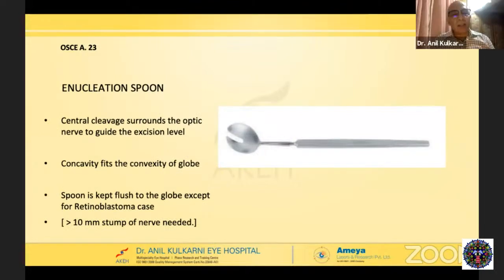The central cleavage is the one which surrounds the optic nerve to guide the excision level. And the concavity of this fits the convexity of the globe. Normally the spoon is kept flush to the globe, excepting in retinoblastoma cases where you need to have at least 10 millimeters of stump of the nerve before you cut that optic nerve.